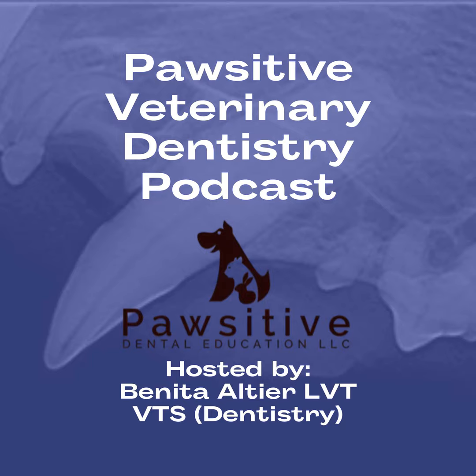And yes, just because clinically the teeth look appropriate, that doesn't mean that radiographically there might not be some hidden iceberg underneath there. I had written up a case report in the Journal of Veterinary Dentistry about a young dog that had come in with a swelling to the side of the mouth. It had a beautiful full set of teeth, and there was an extra supernumerary tooth that was impacted within the bone that was causing an issue.